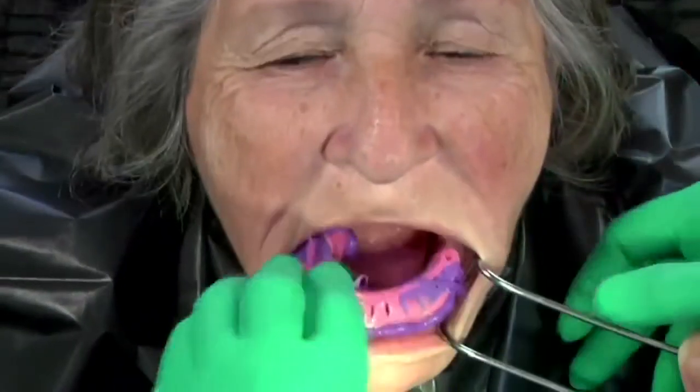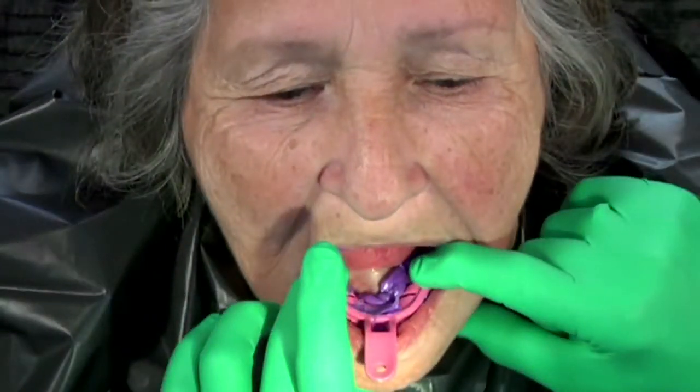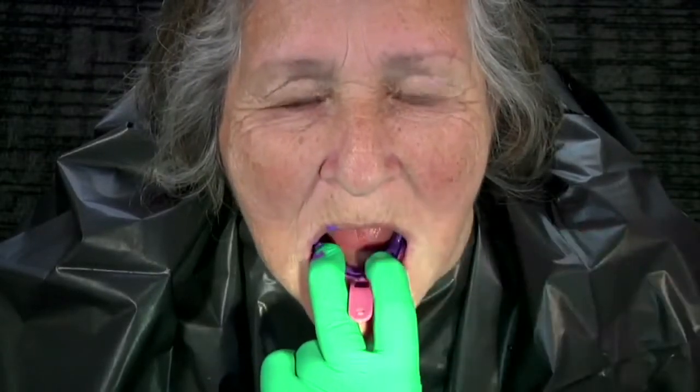Place the tray into the mouth and seat. Ask the patient to go through facial movements that will identify the correct functional peripheral border. Ask patient to suck outward firmly, then smile strongly, and finally move tongue outward and around.